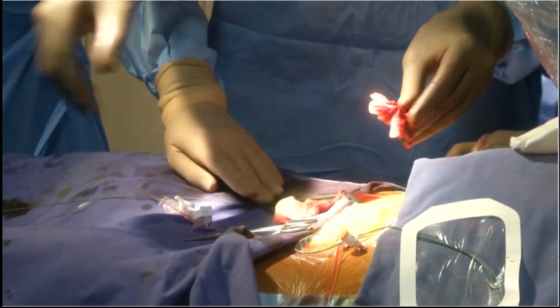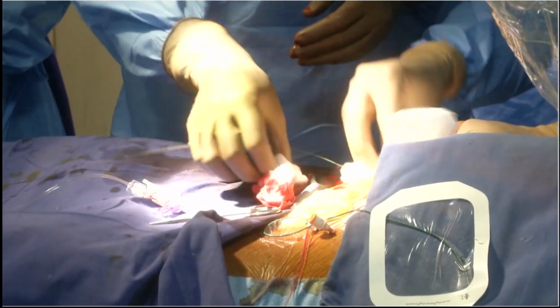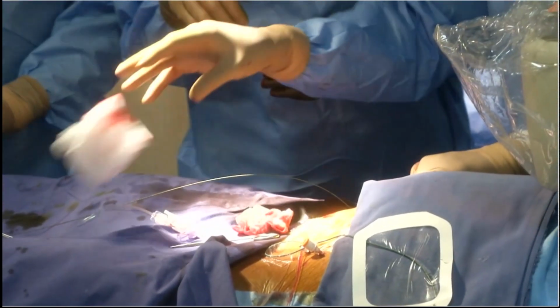Sengottuvelu, can you discuss the location of the 2 ProGlides you are going to use? So we are now planning to do 11 and 1 o'clock.